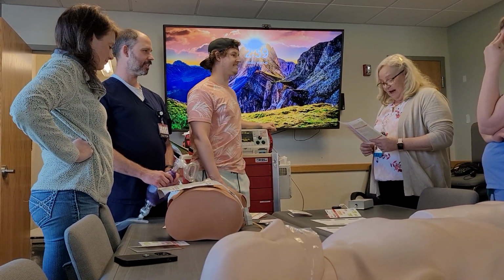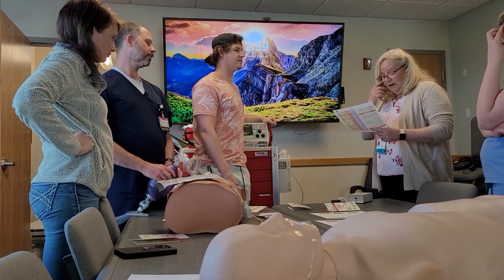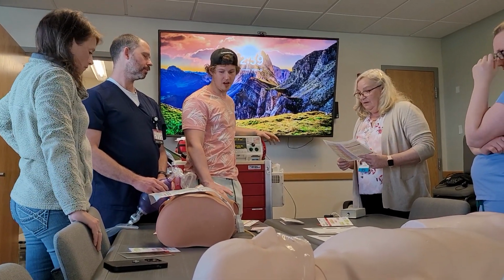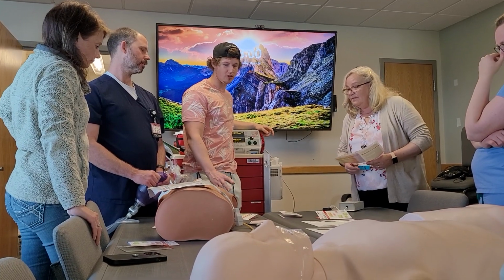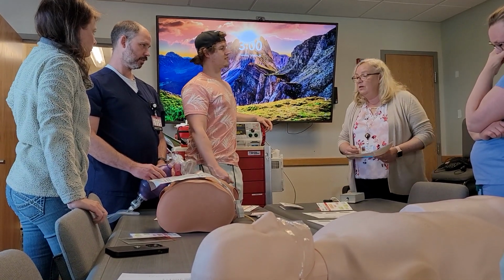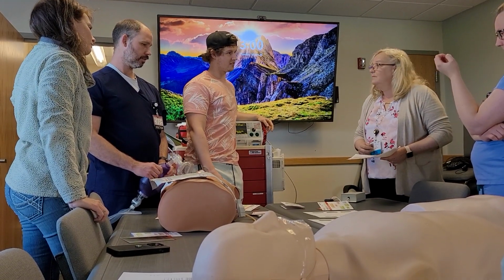Okay, so now we're at sinus tach. We're going along at 126 a minute. She's starting to wake up. Alright. So I would just stop, watch the monitor, do ROSC protocol afterwards. And okay, what are we gonna do in our ROSC protocol?